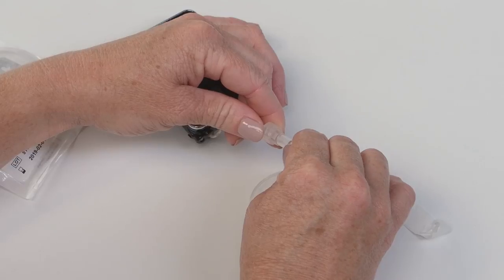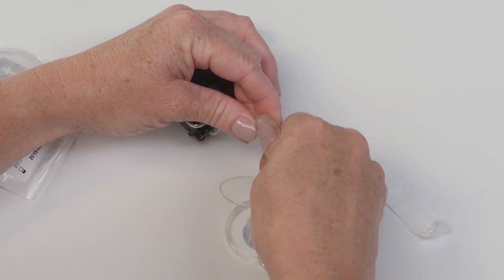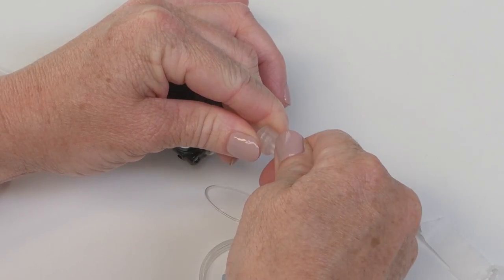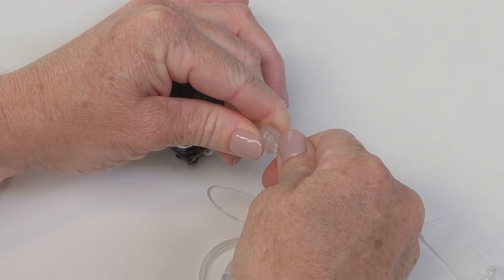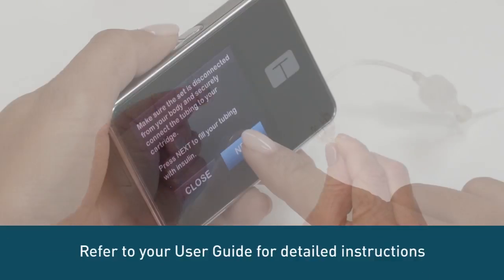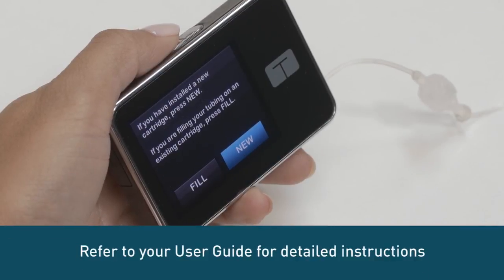Next, attach the infusion set tubing to the tubing lock connector on the cartridge. Twist the tubing lock clockwise until finger tight and then twist another quarter of a turn to ensure a secure connection. Remove the circular protective cap and fill your tubing according to the instructions in your user guide.